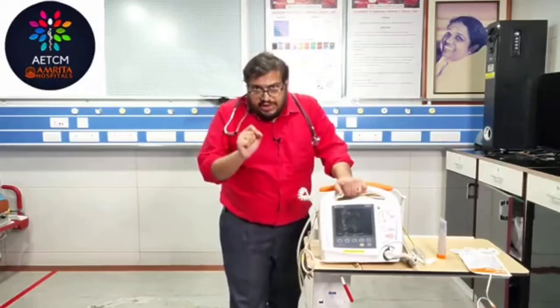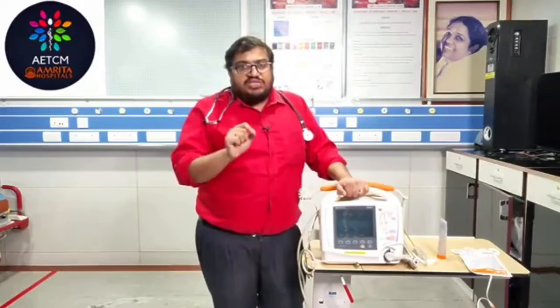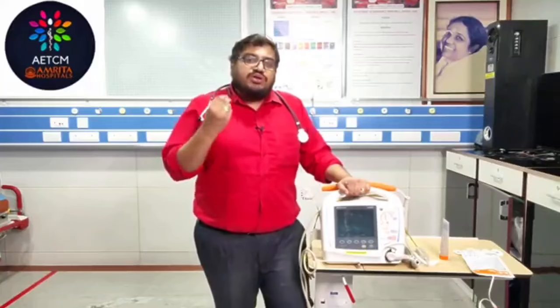In defibrillation, we use it only in a cardiac arrest where we find a shockable rhythm. Defibrillation means you are using your defibrillator in a case of cardiac arrest where you have a shockable rhythm. The next question is, which are the shockable rhythms in a cardiac arrest? There are only two: pulseless ventricular tachycardia and ventricular fibrillation. These are the two rhythms where you have to deliver defibrillation in case of a cardiac arrest.